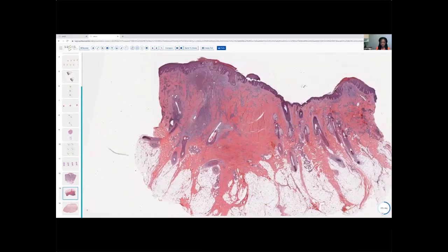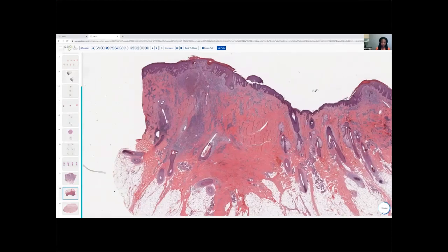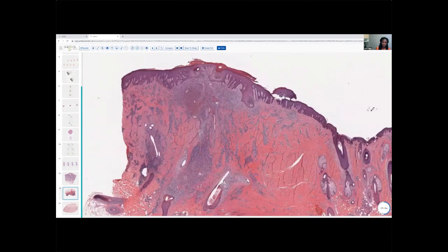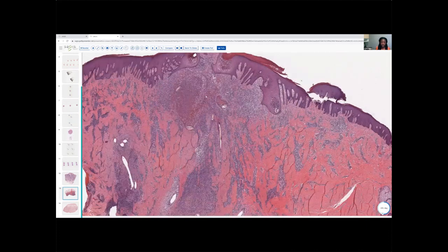And what's striking here is that you just seem to have this breakdown, this busting open of your hair follicles, right? These follicles are breaking open. And this destructive component is appreciable too, in the fact that you have this red blood cell extravasation, you have bleeding essentially with this whole destructive process.